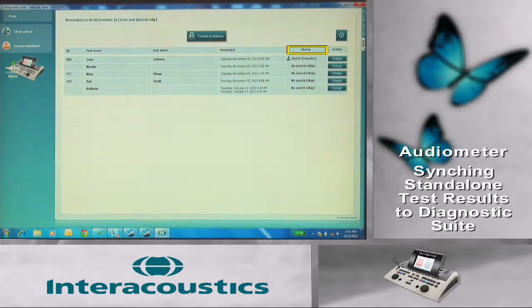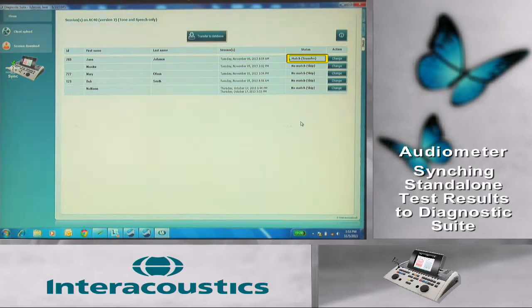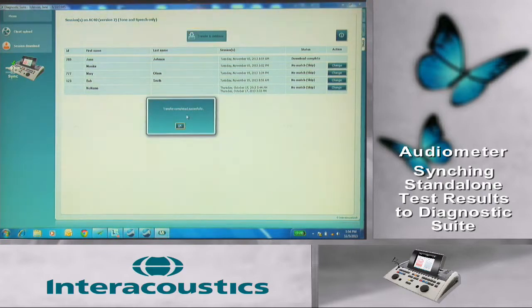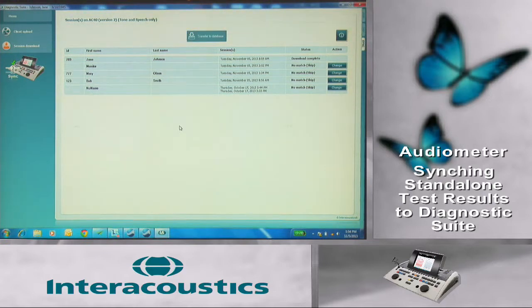The column on the right labeled Status will show Match Transfer when the client name matches within NOAA and the audiometer. When Match Transfer is listed, select the Transfer to Database icon to download the session into NOAA. The transfer will occur and the Diagnostic Suite status column will change to Download Complete.